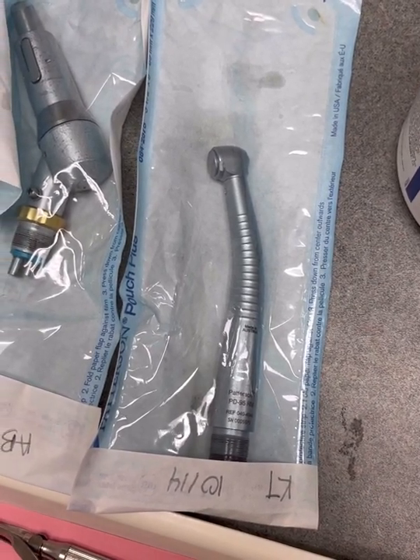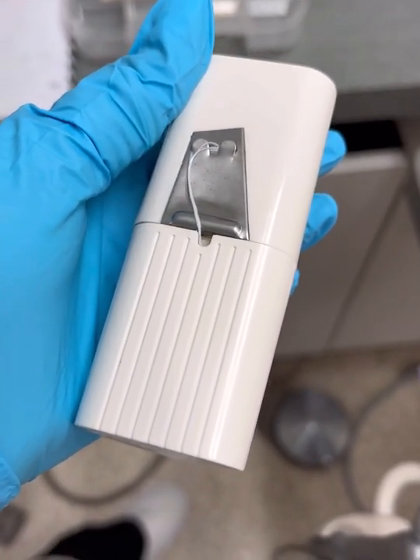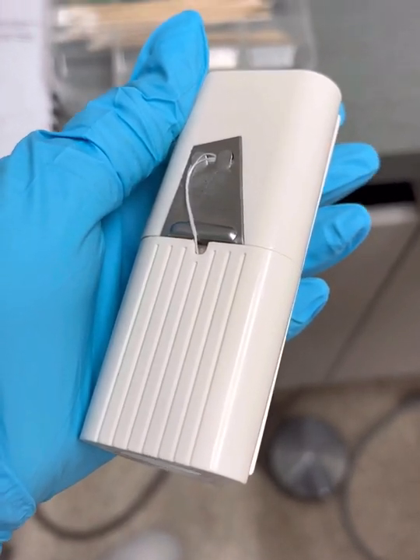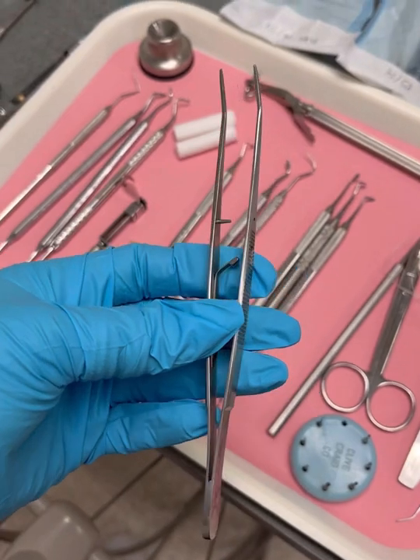Then you will floss the contacts and give post-op instructions. After that, you can dismiss the patient and record treatments in the patient chart. That should summarize the composite procedure.